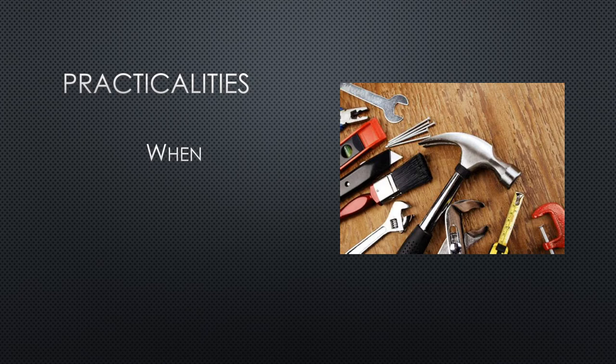So there is a school of thought that the first rhythm pulse check should be about identifying a shockable rhythm, and if you do not find a shockable rhythm, then at the second rhythm pulse check, bring in the ultrasound. And that's pretty reasonable. Personally, I like to perform it right at the beginning at that initial pulse rhythm check. So as soon as the paramedics have transferred the patient across and they've moved their trolley out of the way, I'll move the ultrasound machine in, place the probe in the subcostal position, and then once the defib pads are attached, we've got someone looking at the monitor, someone feeling a pulse, then we'll stop chest compressions and I'll perform my echo right there at the beginning.